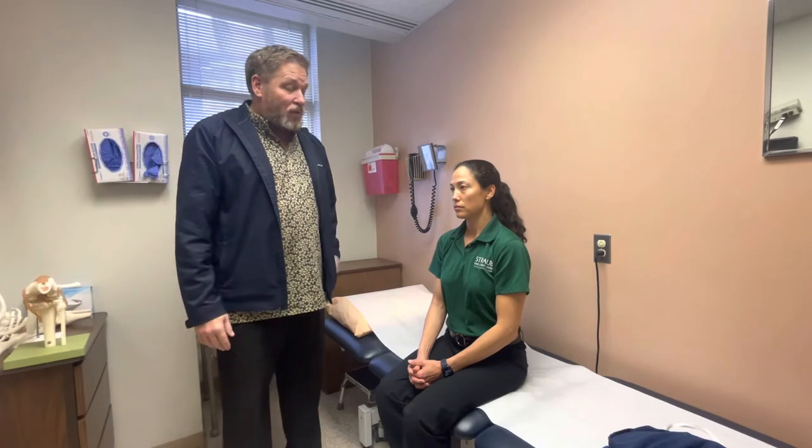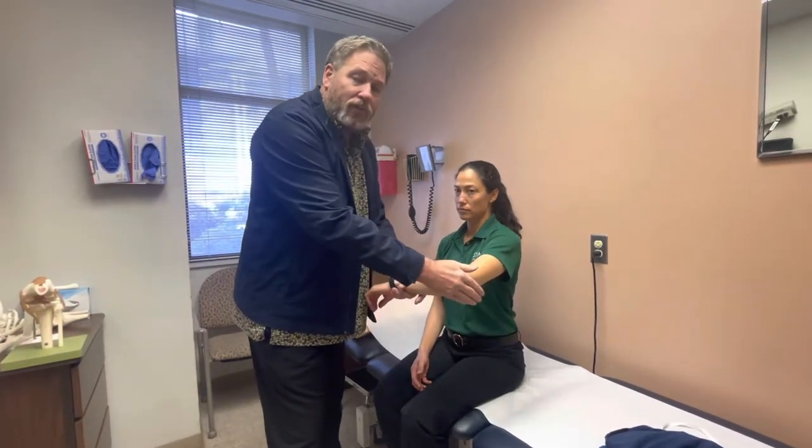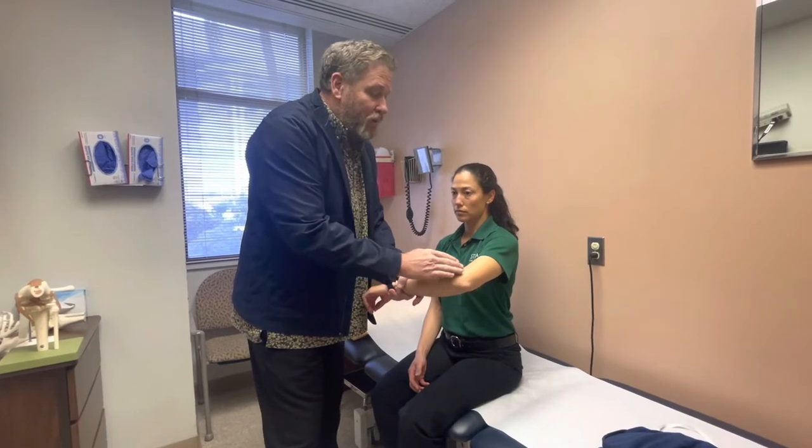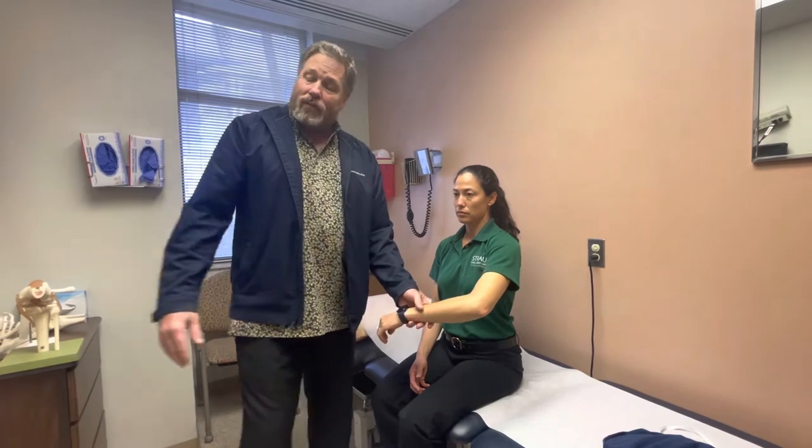The idea behind the wrap is to put gentle pressure on the olecranon bursitis and the fluid inside, so the fluid goes back into the system and not into the bursa. One method of doing that is to employ a simple ace wrap.